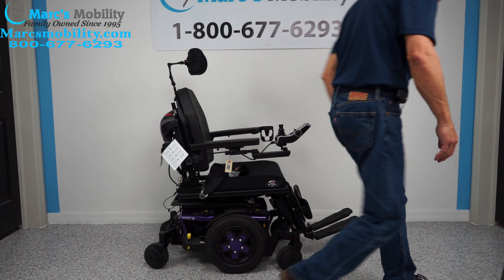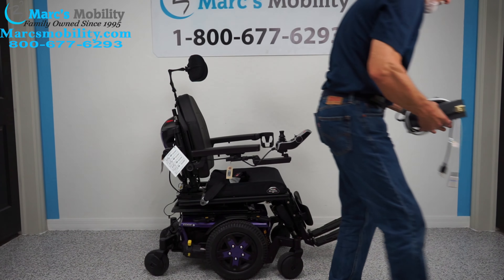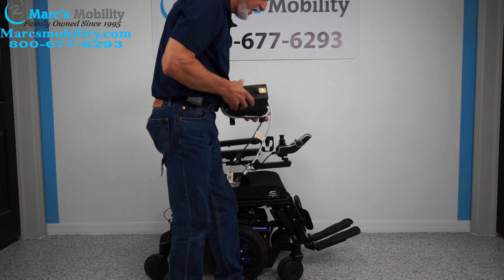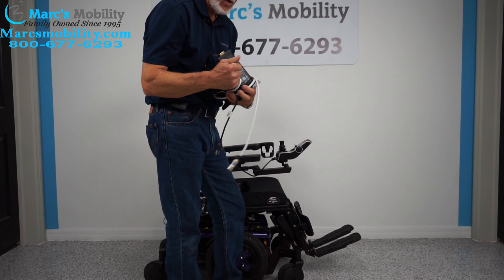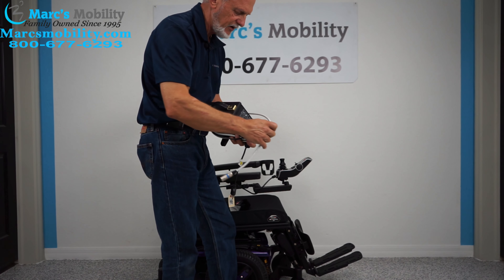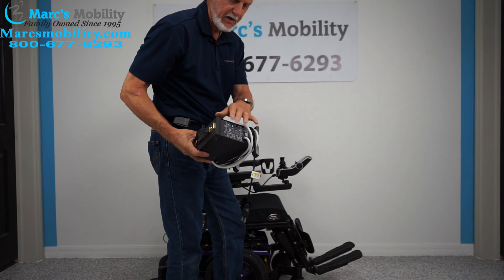When you charge this chair, you'll take your Quantum charger right here and plug it right below your joystick. As soon as the light goes from orange to green, the charger will cut off. The light will still be on, but it won't be charging.